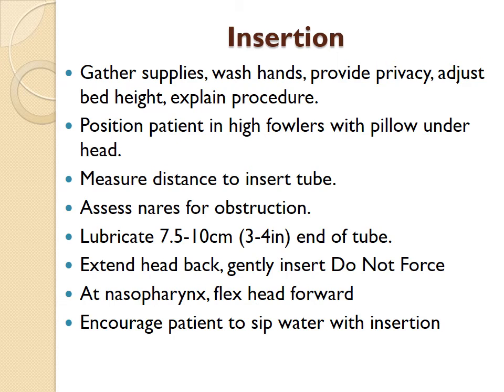If the second time you're trying to place it, you're using the other nares and you are still meeting resistance, you first of all never ever ever force, and secondly, after 2 attempts and you can't do it, you call the hospitalist, the healthcare provider, either the doctor, the nurse practitioner, whoever is taking care of this patient.